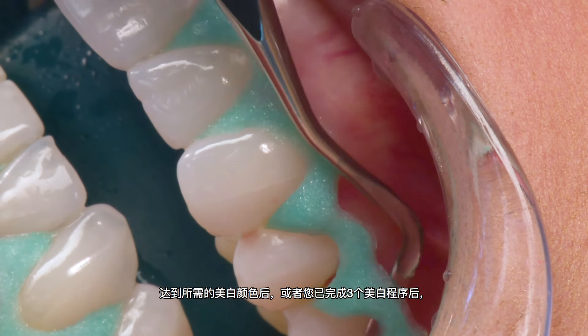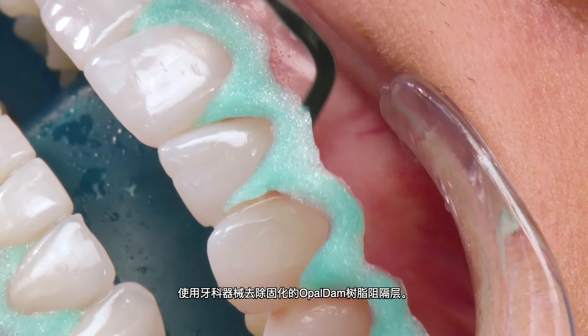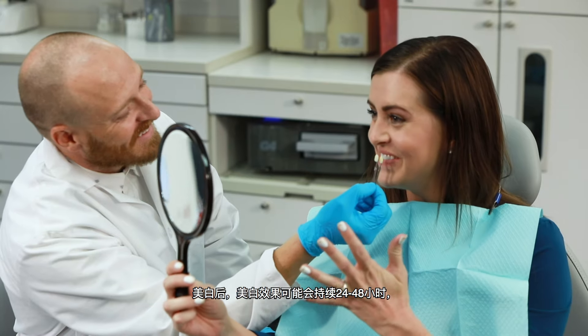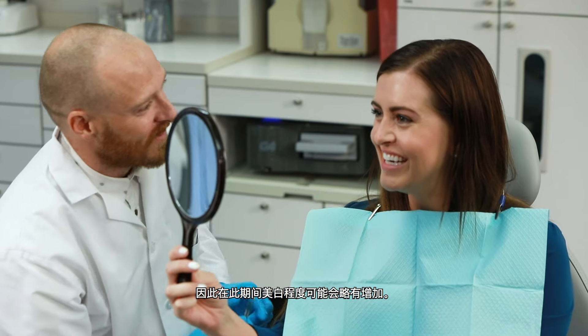Once the desired shade of white is achieved, or you have completed three applications, use a dental instrument to remove the cured Opal Dam resin barrier. Whitening effect may continue for 24 to 48 hours following whitening, so a slight increase in whitening may be realized during this period.